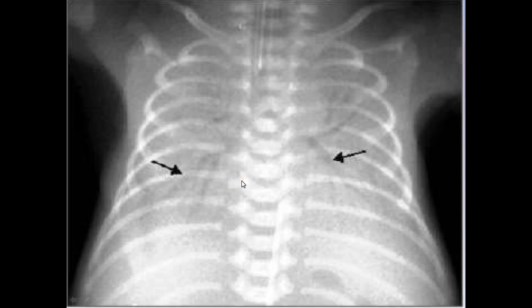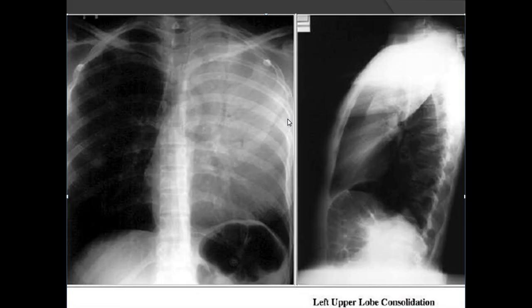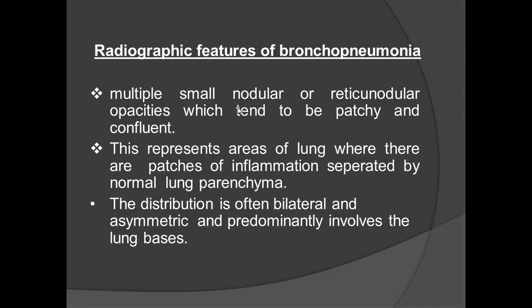In a preterm neonate with respiratory distress syndrome (RDS), surfactant deficiency causes both lungs to appear diffusely opaque and hazy, with air visible within the bronchi — this is the air bronchogram sign. Another example shows lobar pneumonia of the left upper lobe and lingula with white opacities and air visible within bronchi in a linear branching pattern — again, the air bronchogram sign.